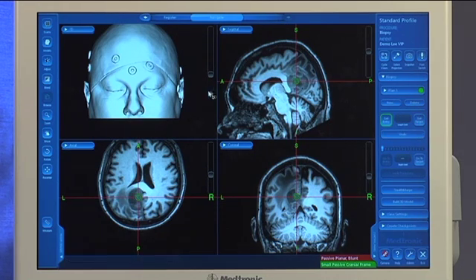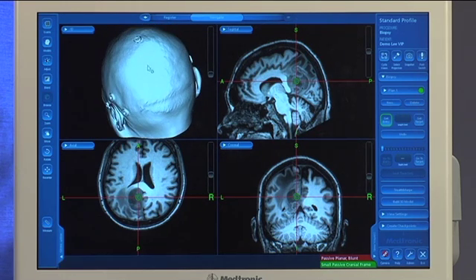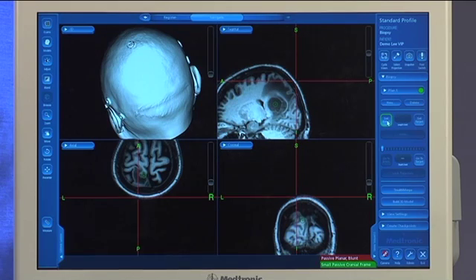You want to do the same thing for your entry point. Typically what I do is I identify my entry point on the 3D model, so I can come in here and click, and then I can modify in any of the other planes as well. I'm going to go ahead and hit set entry, and here you'll see that a surgical plan has been identified.